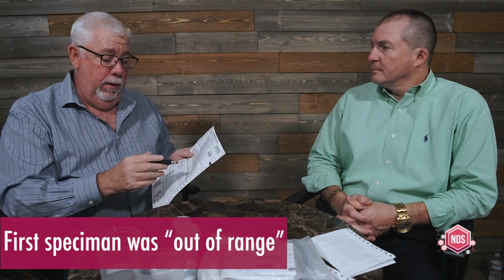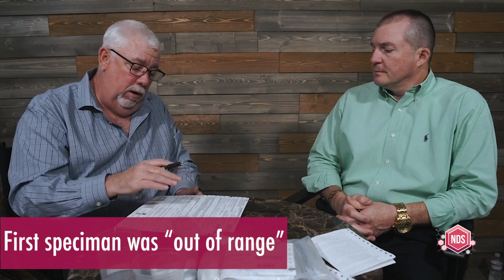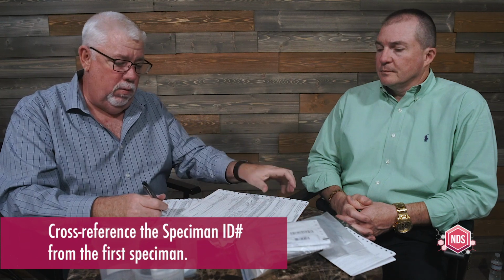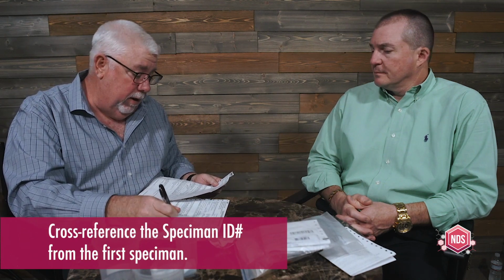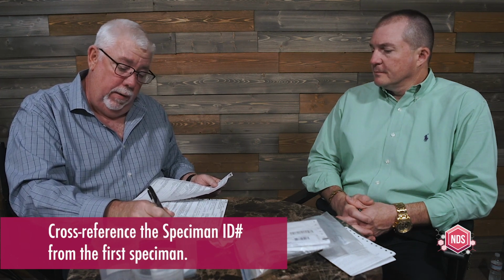So on the form, there's an observed box, and the box says enter remark. So the remark is first specimen out of range. Then we're going to put 2 of 2. This is the second of 2 specimens. And we're going to cross-reference the specimen ID number from the first specimen that we collected. This way they cross-reference each other. And then we would finish the rest of the collection process, finish filling out the form, seal it up, give you your copy.